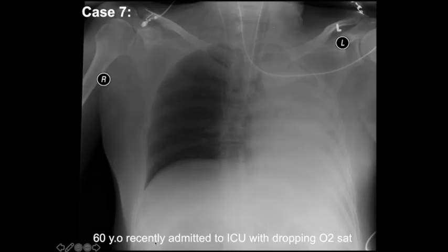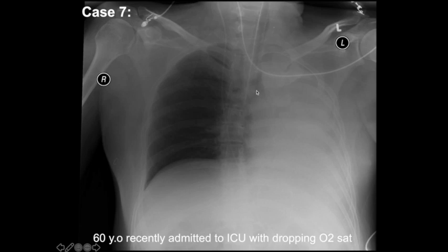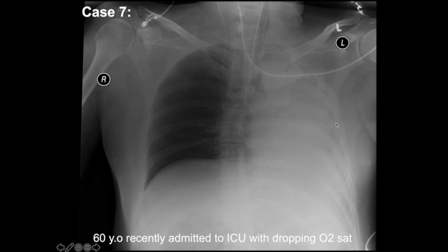Case 7: a 60-year-old patient admitted to the ICU with dropping oxygen saturation. Step one is to look at lines and tubes. Here's an endotracheal tube going down the trachea. The carina is right here, and this endotracheal tube goes beyond the carina and into the right main stem bronchus. The entire left lung is opacified — there's whiteout of the entire left lung — and the heart and mediastinum are shifted towards the left. The right lung is aerated and the left lung is not, resulting in left lung collapse. When you have collapse, you have pulling of the mediastinum towards the volume loss.